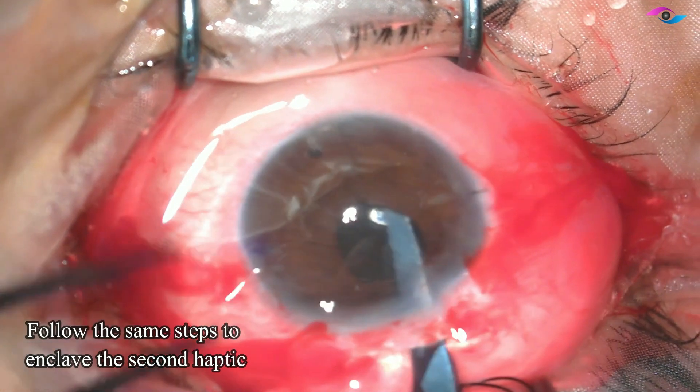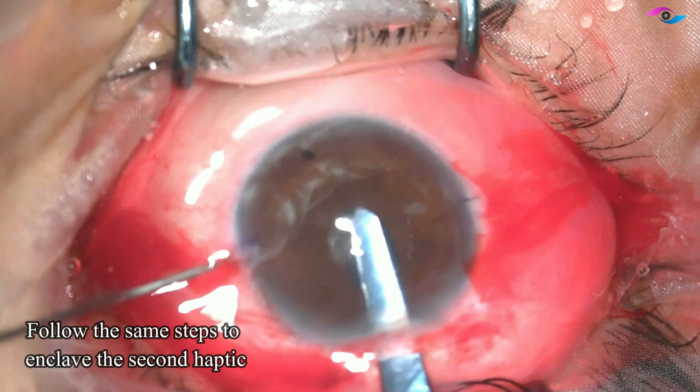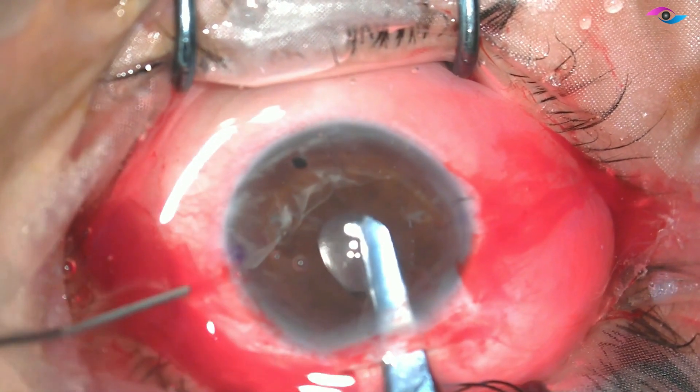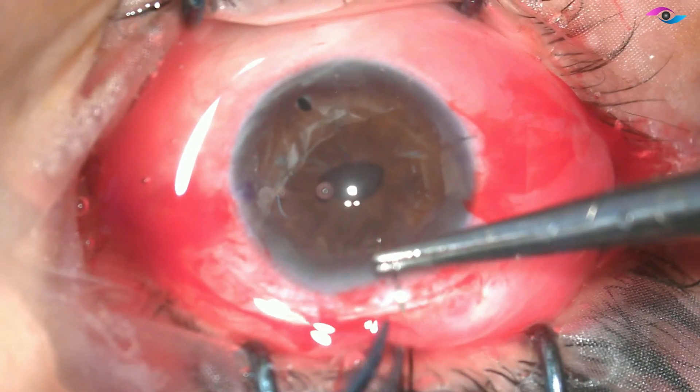Now we repeat the same step on the other side — push it gently down and then use a 27-gauge cannula and press the iris down. Before we release the forceps, we can move a little and make sure that the enclavation is complete.